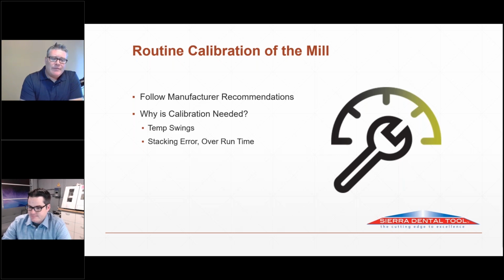You don't necessarily need to baby it, I would say, but I would baby it. It's probably the second most expensive thing in the lab, if not the most. Take care of it. You want to get the most value out of that machine that you can. And by keeping it clean, or having a cleaning person take care of it and maintain it all the time, verify how many units you're doing in it, verify the hours on the tools. There are a lot of different consistencies to keep your machines in check, where you can quickly realize, oh, this is starting to go out of calibration, because you're on top of it.